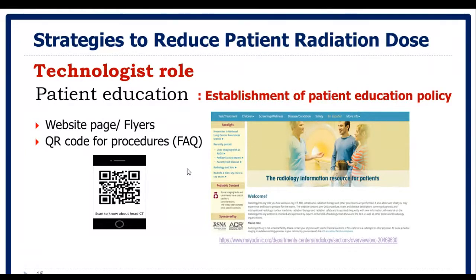frequently asked questions. The frequently asked questions associated with the procedure can be sent through emails or through WhatsApp, for example. So the patient will read these guidelines and he or she will become relaxed, and when coming to the procedure, this will minimize the technologist's effort to explain the procedure and to assure the patient regarding any given CT procedure.